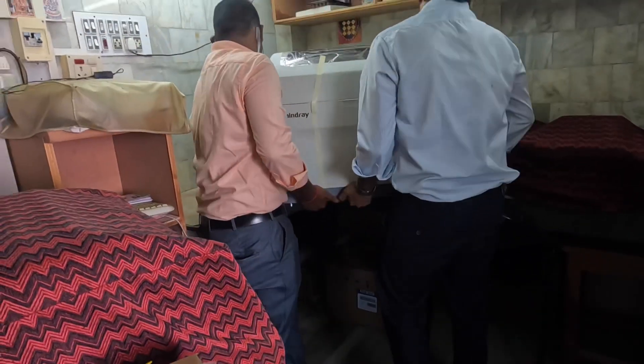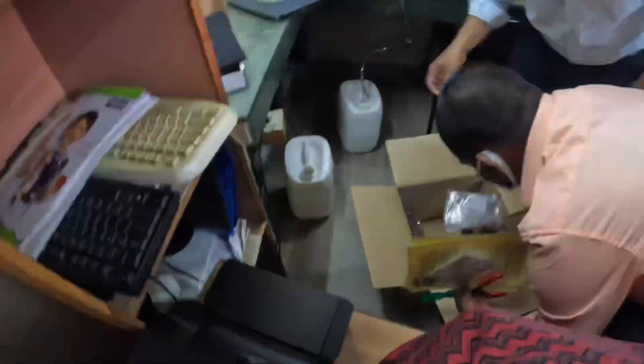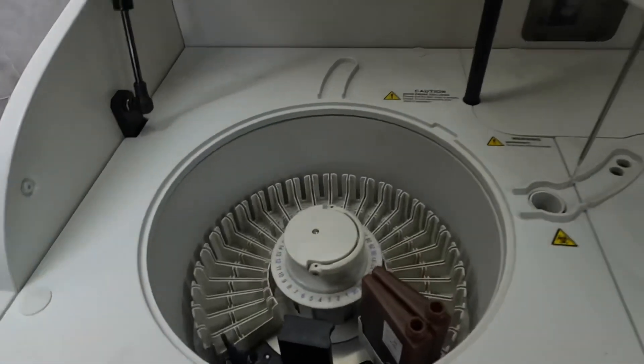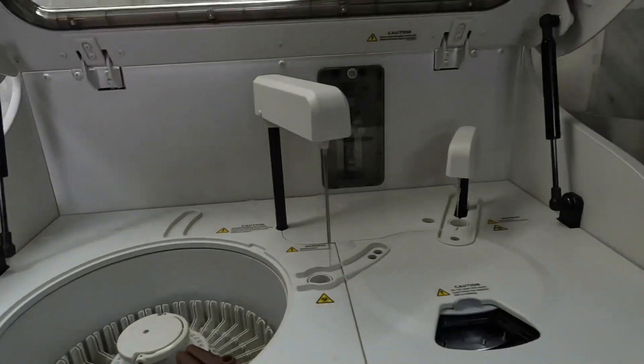We are now shifting the machine — without the box, just the machine itself — up the staircase into the laboratory. We have come to the laboratory now and we are placing it. We are also unboxing the other boxes that came to the laboratory for installation. We have received all the SOPs which came with the machine.